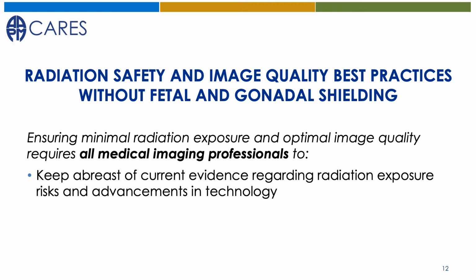As professionals, we must also keep abreast of the evidence presented in the most current peer-reviewed literature regarding radiation exposure risks and advancements in radiologic equipment so that we can promote best practices and educate our patients, their families, and our colleagues. It is our responsibility to understand best practices in terms of shielding so that we can provide excellent and safe patient care. Remember, current research suggests the discontinuation of fetal and gonadal shielding only, not the shielding of the thyroid, breasts, or lens of the eye.